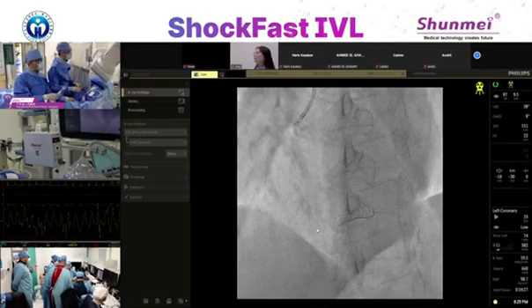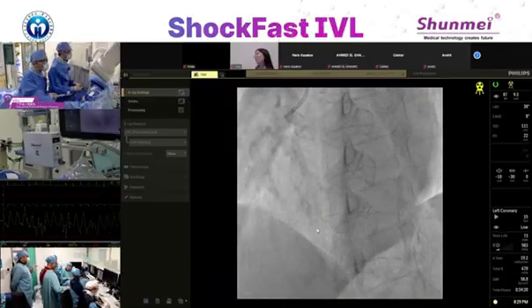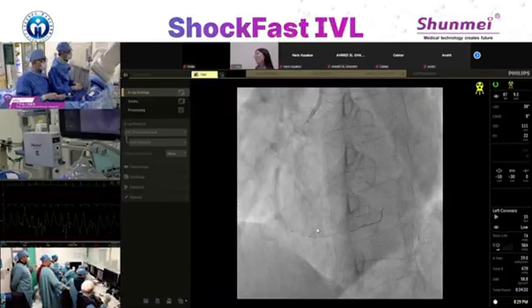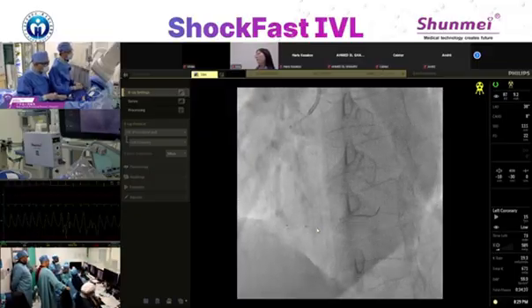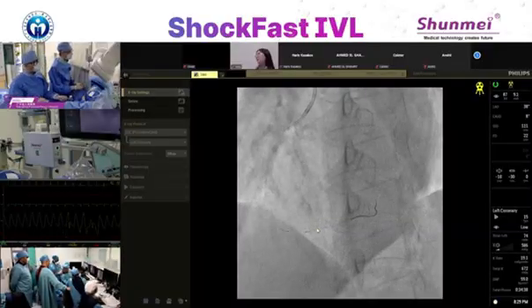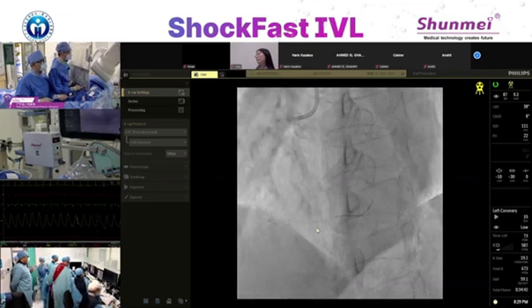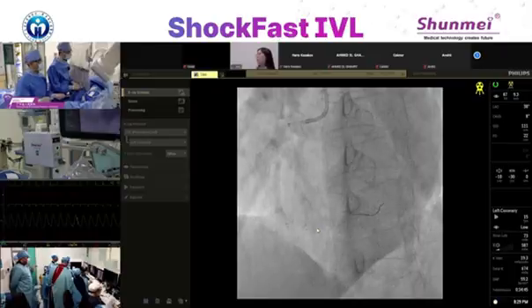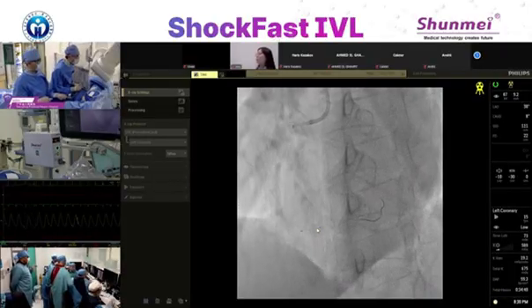And for the proximal stent, because we dilated up to 26 atmosphere, that's what we can do. We did all we can do, I think. So I'll leave it. I hope this one can go.